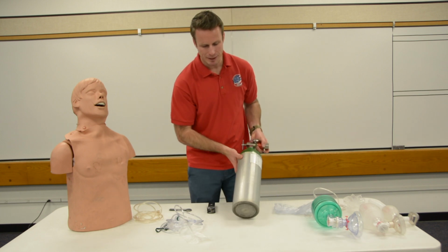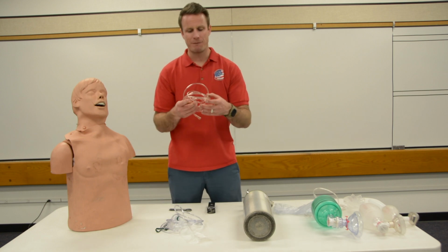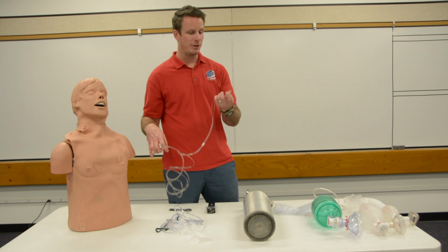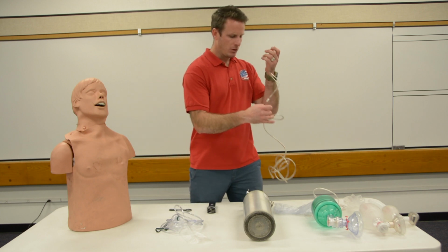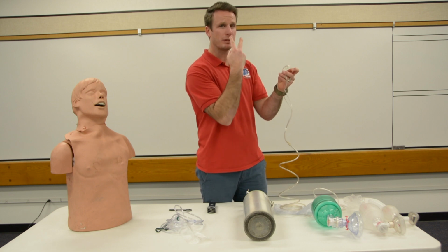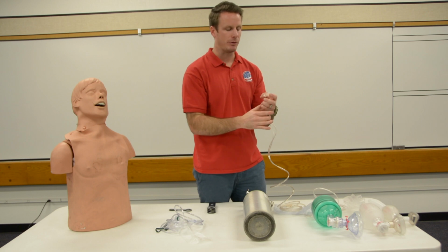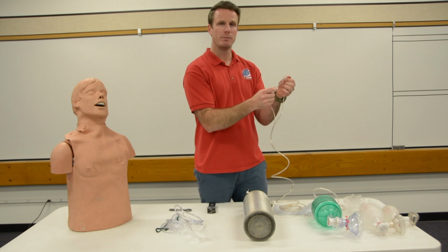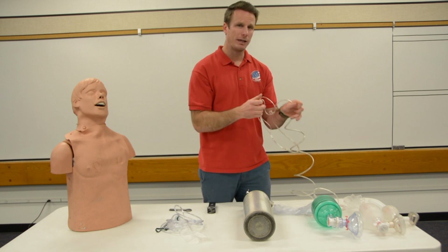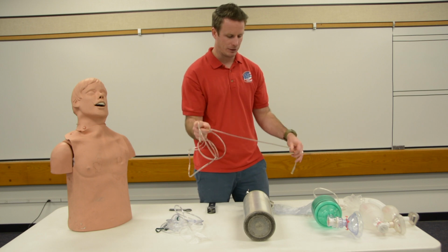So I'm going to lay my tank down and make sure I keep it safe. I'm going to select my first oxygen device, which is known as a nasal cannula, or nasal prongs. You can see here that my nasal cannula has these two little prongs that are inserted into the patient's nose, and then this tubing wraps around my patient's ear and up around their neck. So that's going to be able to administer low concentrations of oxygen to my patient. Now the flow rate for this is going to be anywhere from 1 to 6 liters per minute.